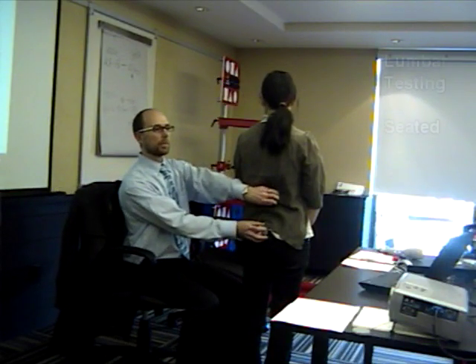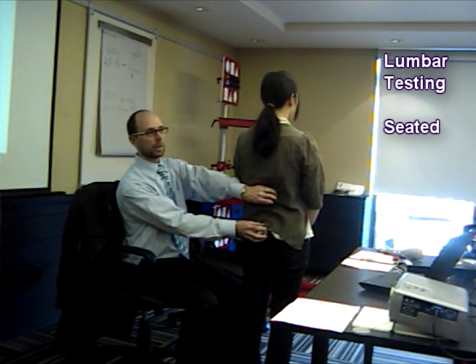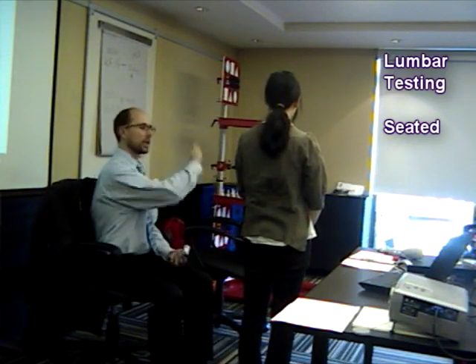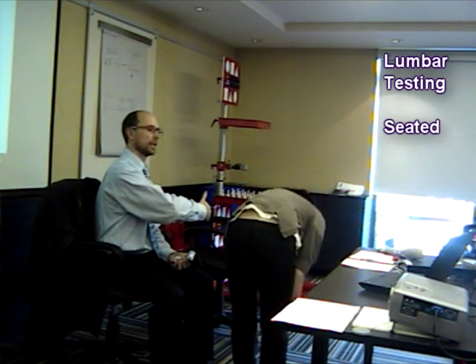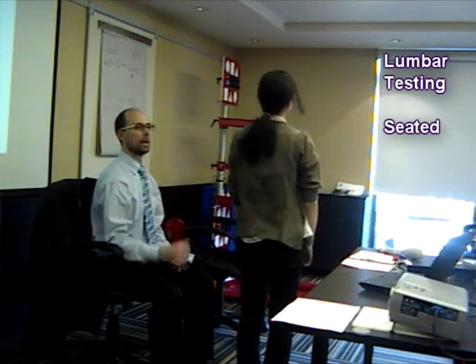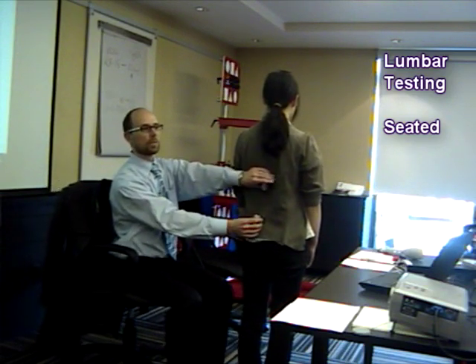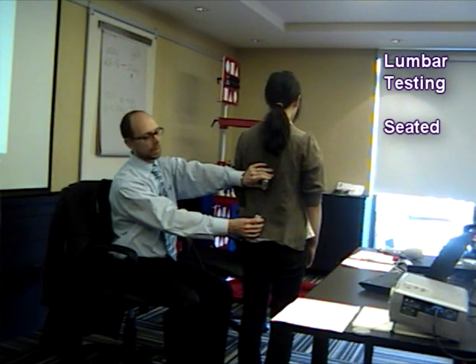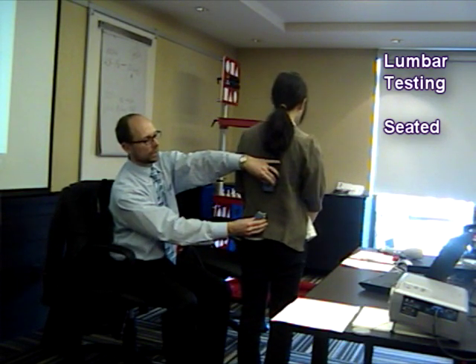One mistake people make is to hold it like so — it's a little less awkward for yourself to actually be sitting down while you're performing this particular movement. Same procedure as before: give your client the instructions — they're going to bend forward as far as they can go. Make sure they understand the instructions, coming all the way back and all the way forward. Then we're going to place our inclinometers in place. We're going to do one trial for flexion, one for extension, and we do side flexion — bending off to the left and to the right.